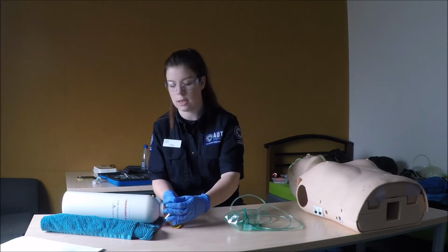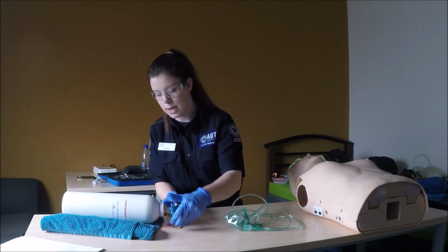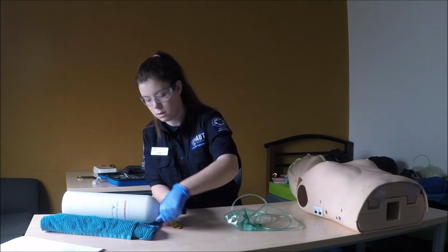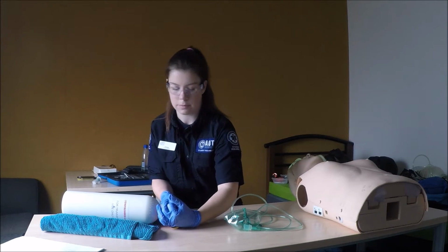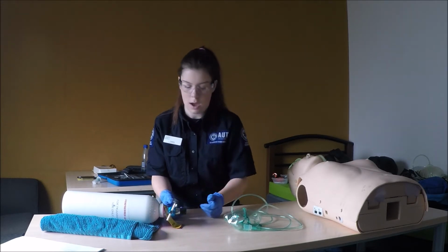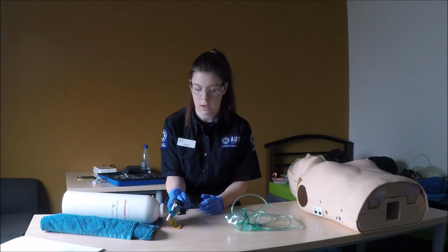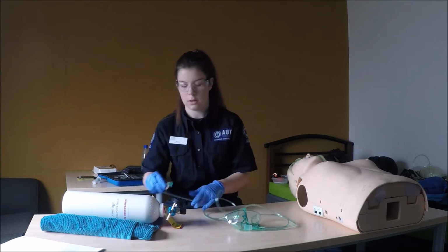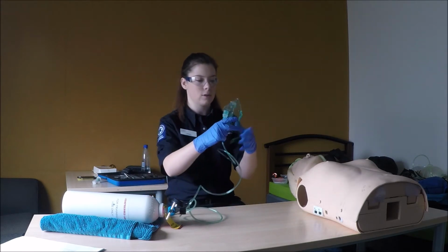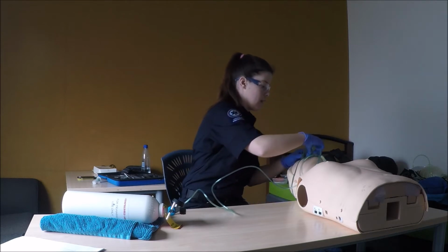Before we give oxygen, we'll check that this regulator has a Bodok seal, which it does, and then we'll firmly attach this onto the oxygen bottle. We'll then turn the bottle on and check for a good amount of oxygen and ensure that the flow rates are all working. We'll then attach the oxygen tubing and place the mask on the patient's face, ensuring that we cover the nose and the mouth.